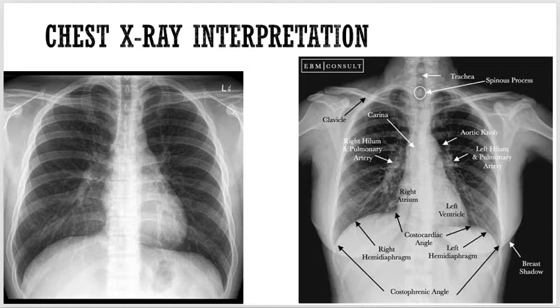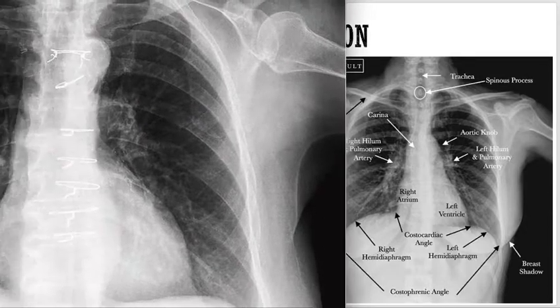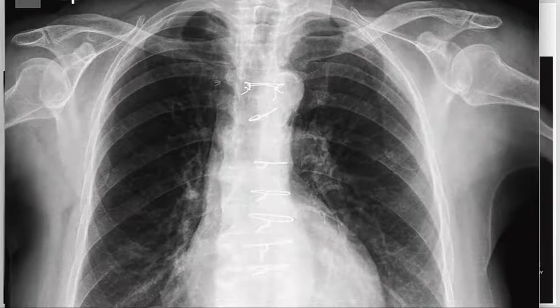Okay, now first of all, before starting any interpretation, what you can see simply here is left and right. But nowadays, when you interpret an X-ray, you can see, like I'm magnifying for you different structures. Can you see these whitish areas, these whitish rings?